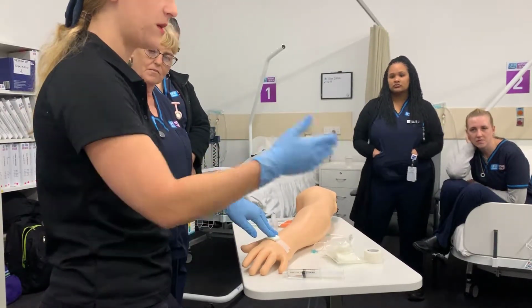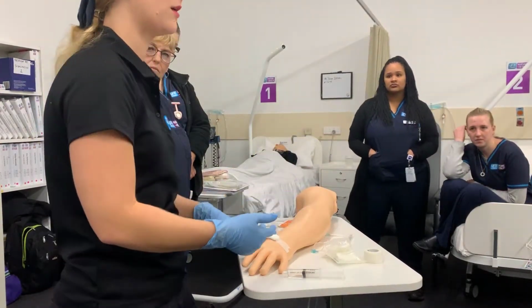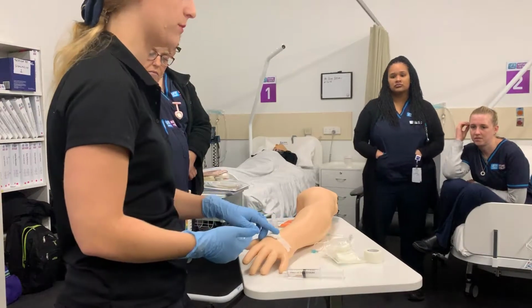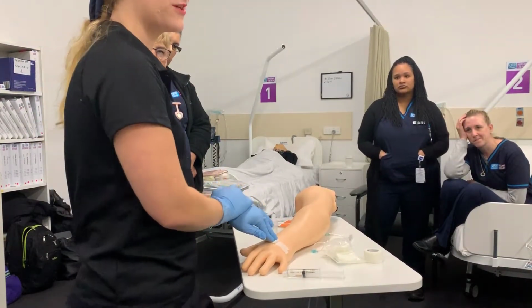But if the family member's not comfortable, or if I know that this person is a big bleeder, or the patient cannot hold the pressure themselves, then I will stay there, okay? Or I'll find a student to hold the pressure.